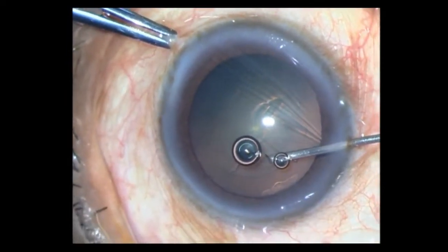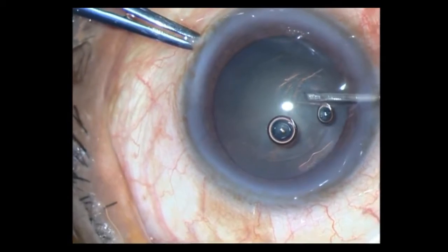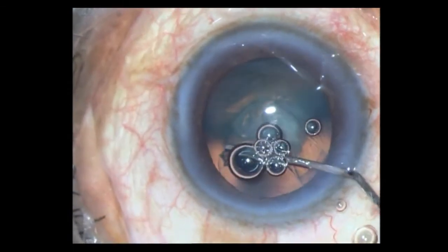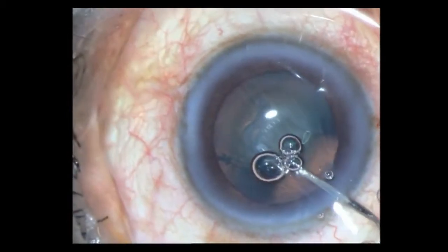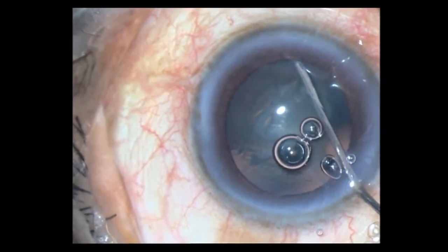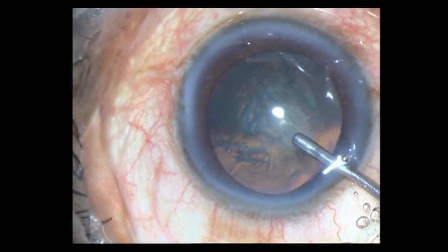Just a little bit of a stutter there, but continuing with the rhexis. With a soft cataract, because you don't have any support, the rhexis can be a bit difficult. There I have done my hydrodissection — decompressing and pressurizing the chamber, then doing another wave just to make sure, pressurizing again and coming out.